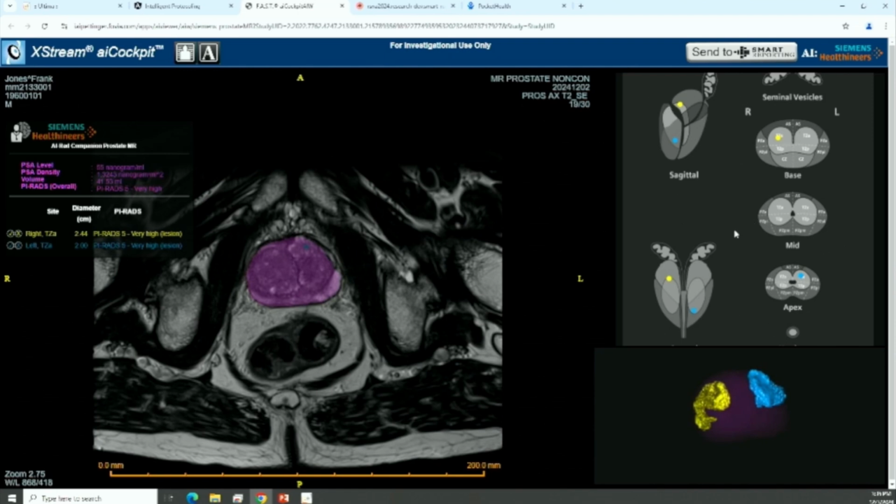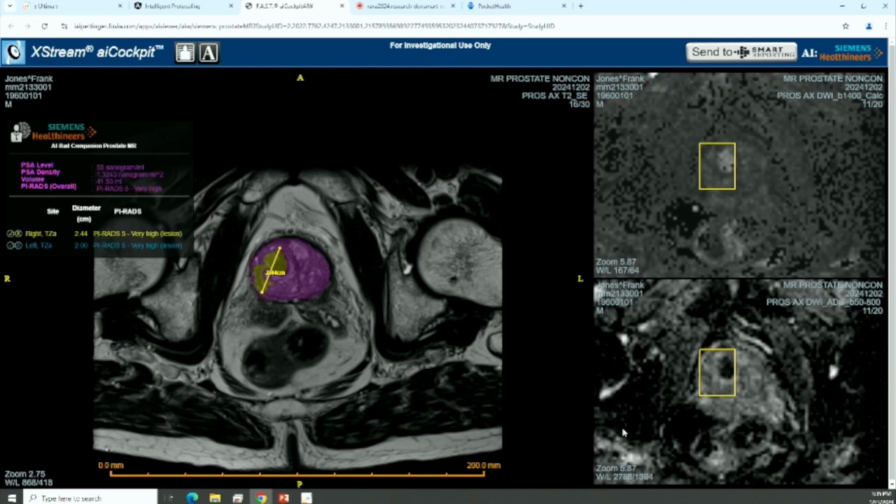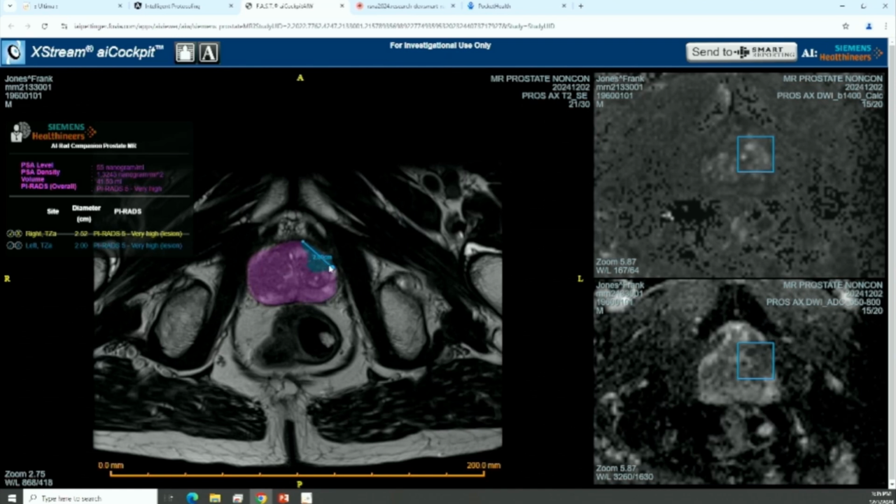In this particular example, we have our prostate MRI, and we have our AI results there on the left, from the Siemens Healthineers AI Rad Companion, which is going to show us a PIRADS 5 lesion in the right anterior transitional zone there in yellow. The radiologist can interact with this finding, so if we disagree with the measurements, we can tweak the calipers, basically change some of the results in that way. In addition, as you can see, the AI algorithm has done segmentation for us, so it's segmented out the prostate gland, in the pink-purple color. And there's some other features as well.